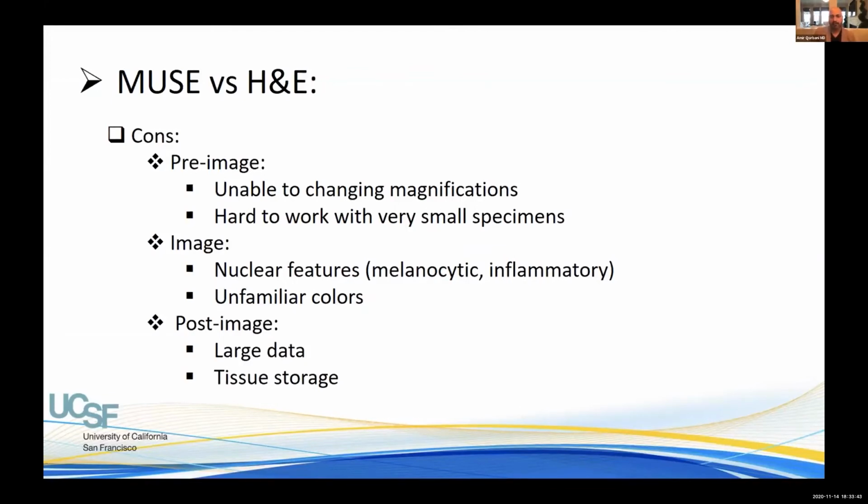It's hard to work with very small specimens, because with H&E, you fix the specimen in the paraffin and it's fixed. When you cut it or examine it, it doesn't move.